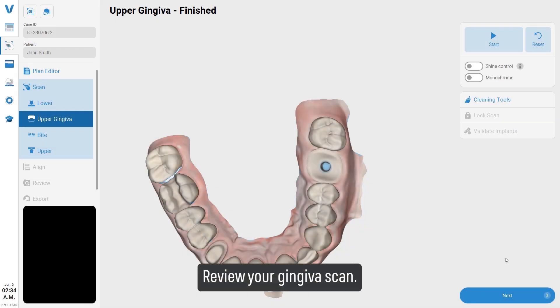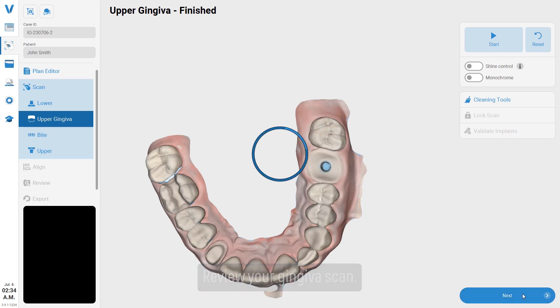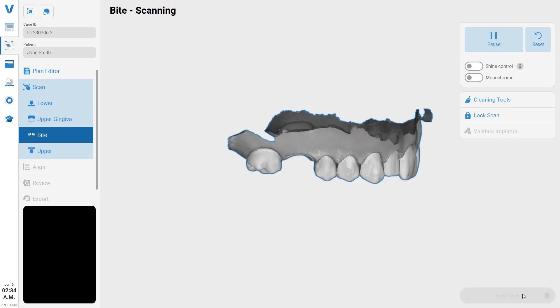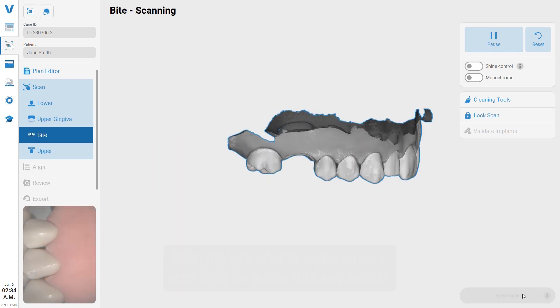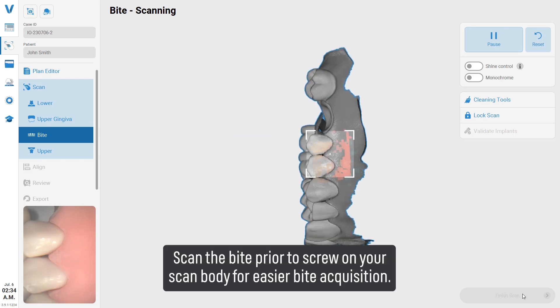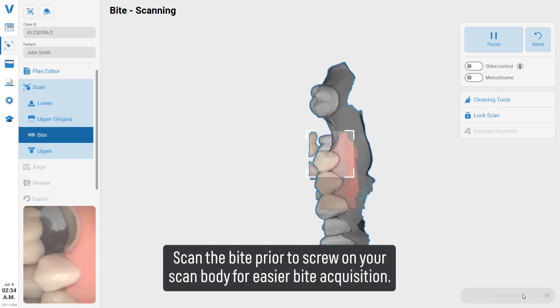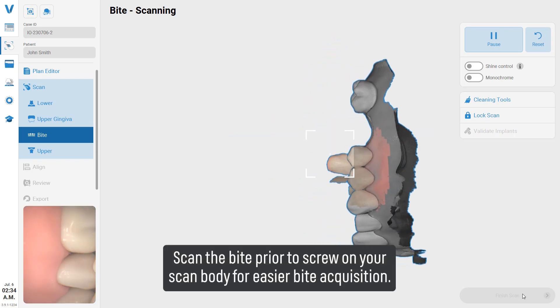Review your gingiva scan. Take a bite scan prior to screwing on your scan body for easier bite acquisition.